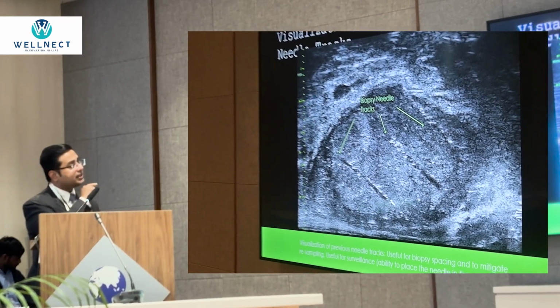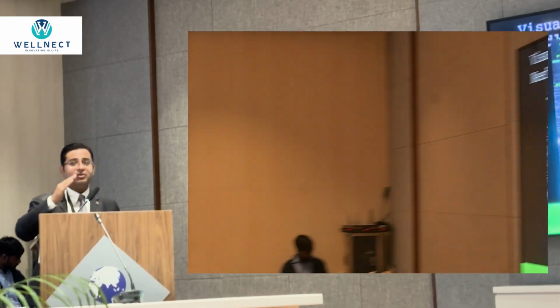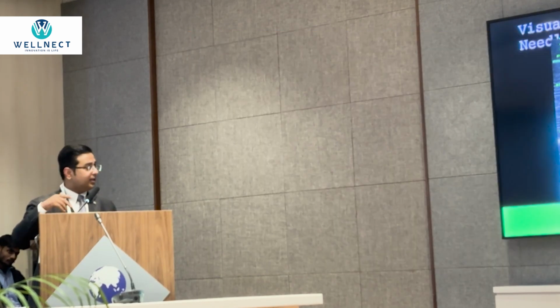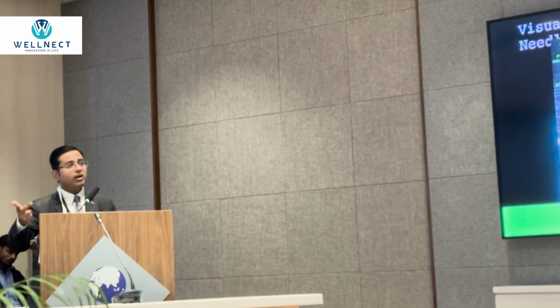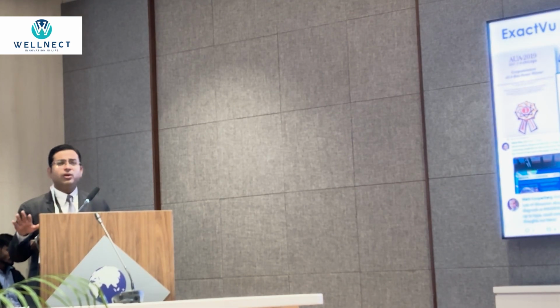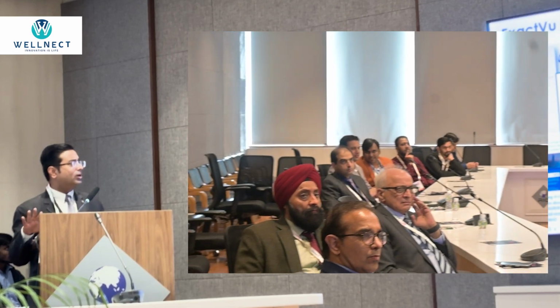But the grayscale itself in micro ultrasound will tell you that here was your previous needle track, which you took a few seconds back. So that is one advantage. And in the second biopsy, you know that this area was already targeted, so you can consider to spare it. There's adequate evidence. So there is no dearth of evidence on micro ultrasound.